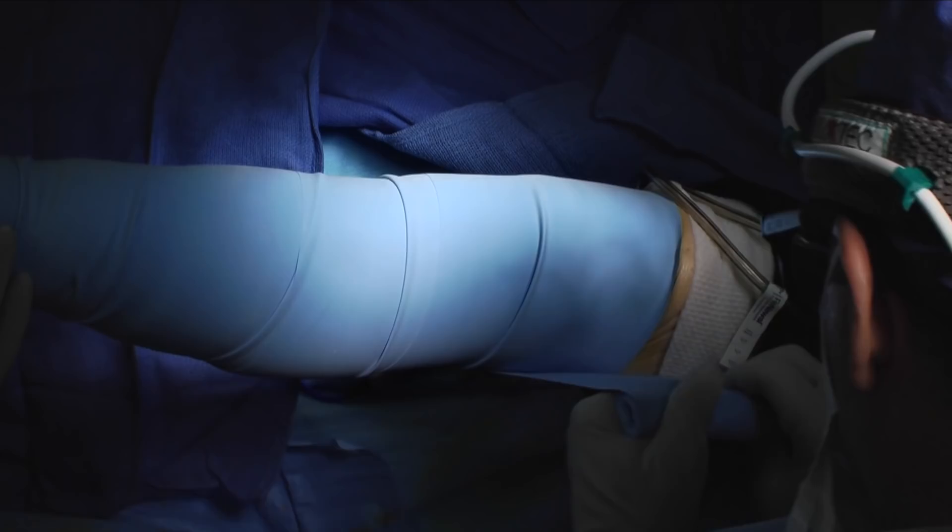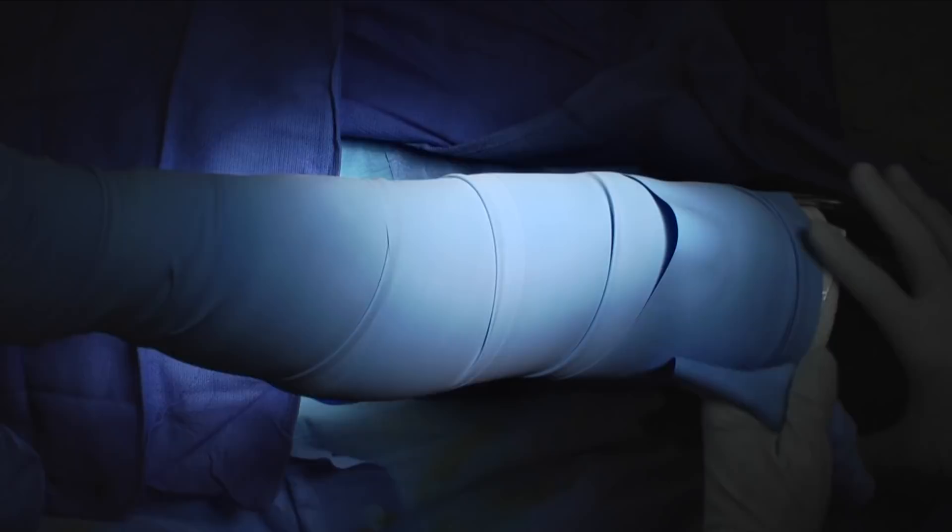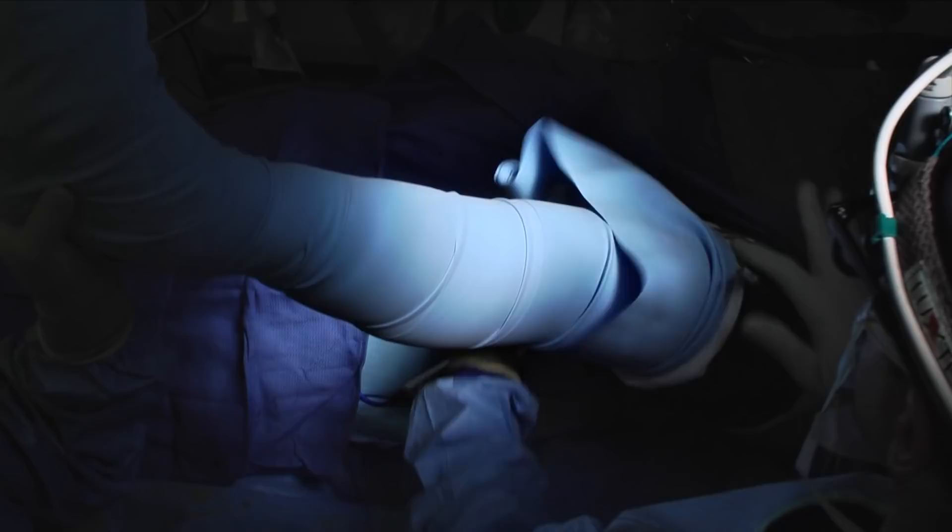The leg is then exsanguinated by elevating it, wrapping it tightly with an Esmarch bandage to squeeze out venous blood, and then inflating the tourniquet to 350 millimeters of mercury for an adult patient.